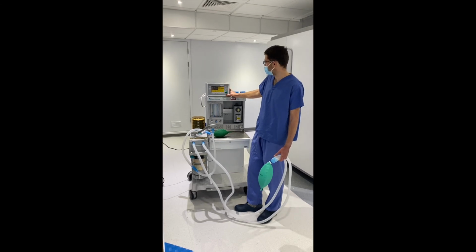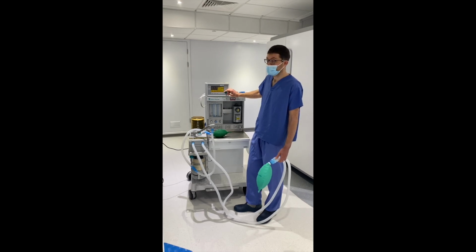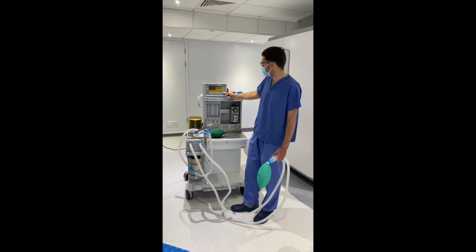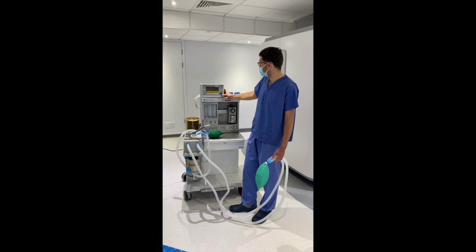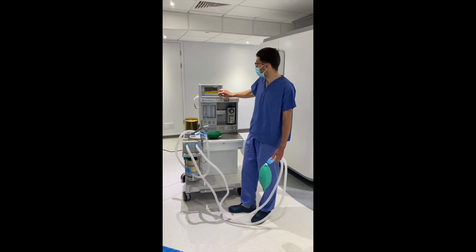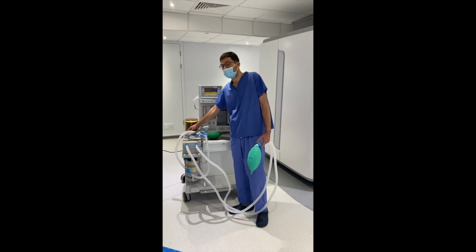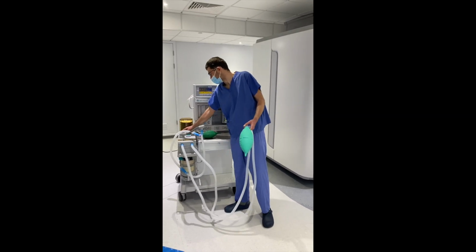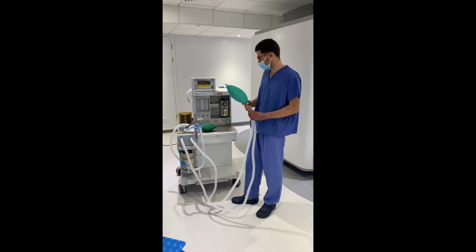And then to change the mode, press this button here, which brings up the menu. And you've got a ventilation mode, and you've got SIMV, PSV Pro, pressure control or volume control. For most ITU patients we would use SIMV. Just to note, if you do change the mode to say volume control, you need to confirm the volume before it will start. Once you've set up your settings on there, to engage the ventilator you switch this green switch that way and it starts to ventilate.